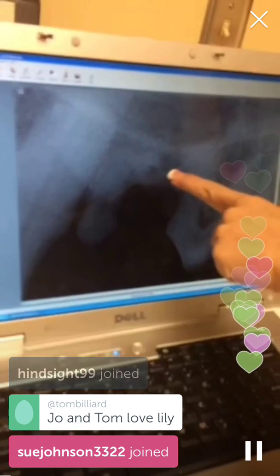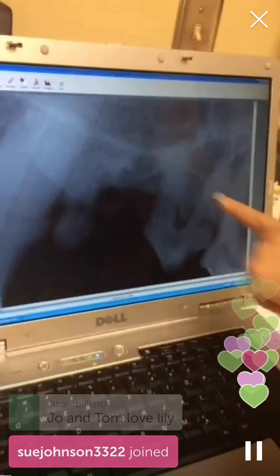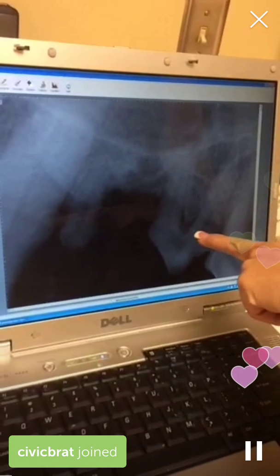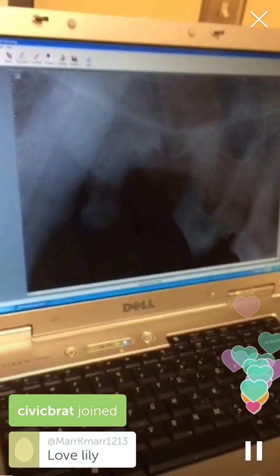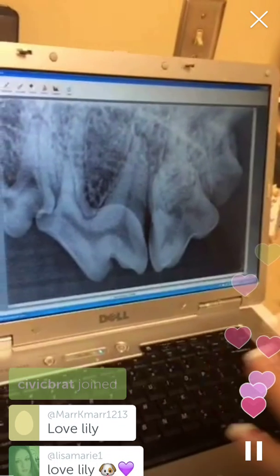We were missing a tooth here. Just missing. And no reactive tissue there. Everything looks fine, and actually this premolar tooth looks absolutely normal too. This is on the left side. So the left side doesn't seem to be involved with most of the chewing because this side had the least amount of pathology.